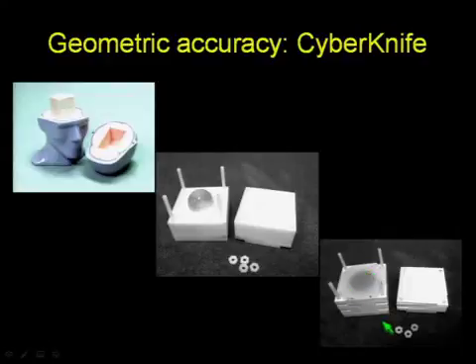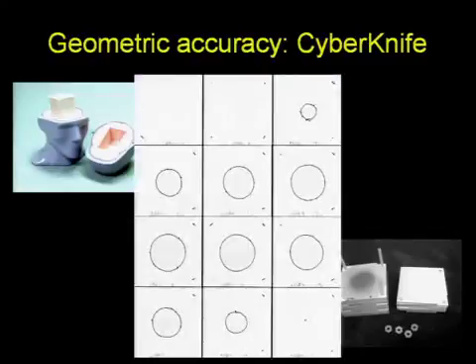And going through the dry run process for this geometric calibration process, the user can analyze the resulting films from this test and assess the intended projection with that obtained or that visualized by GAF chromic. It's a bit of a shame that it doesn't project very well, because on my original slides you could see the blue spots quite nicely coincident with the planned circles.